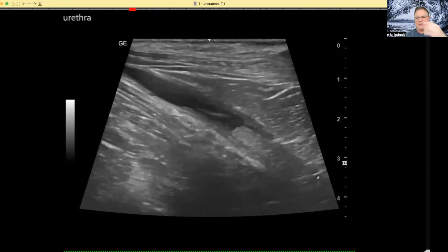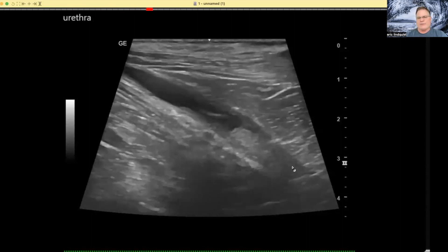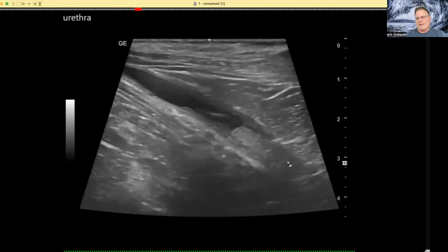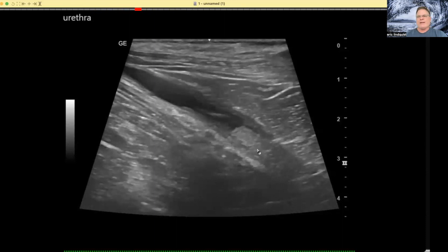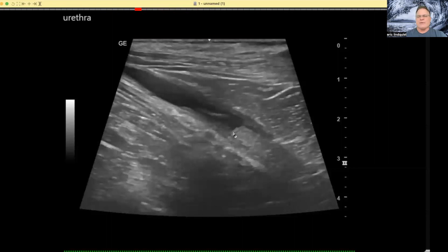It's about two centimeters in length. You can't really see the distal aspect clearly, but since this is a female, a vaginal exam may show the tumor popping right out. This is a key point — if you're not getting into this pelvic urethra, I assure you you're missing lesions, and this is a classic one. Do the regular S-DEP with your microconvex probe, then use high resolution on the clinically pertinent organs. In this patient, dysuria and pollakiuria were in the history — this is exactly the pathology you want to find. Get into that pelvic urethra and don't miss this lesion.